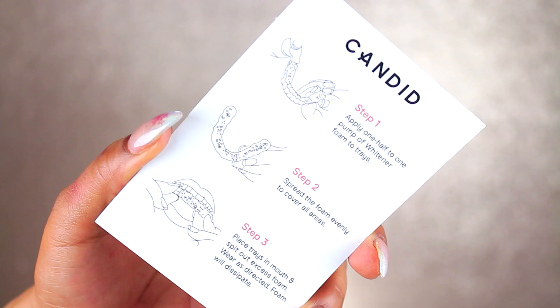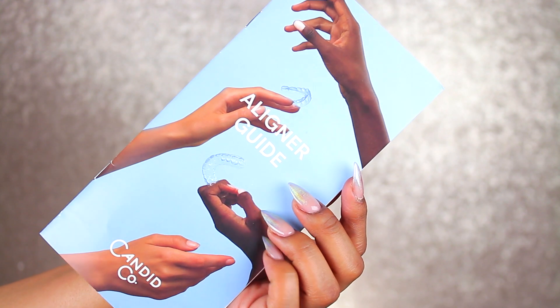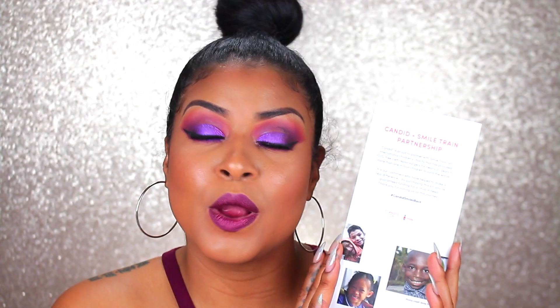You're going to find some information in the box once you remove the stuff from inside. You're going to find information about the whitener and how to use it on the aligners. You're also going to find your aligner guide, which gives you information on the company, all the tools that were included, and some specifics on those. I definitely think everyone needs to read through this before getting started because it has a lot of tips to make your journey successful. They also included a brochure about Smile Train and how they're correcting cleft lips, which is super awesome.